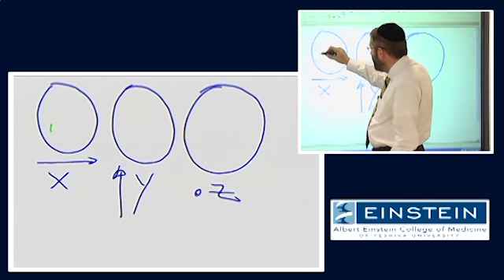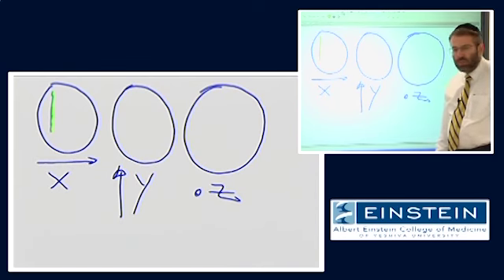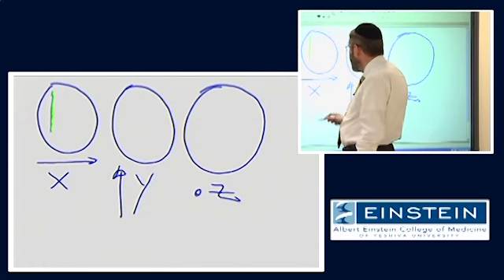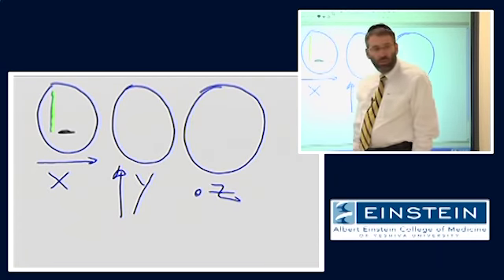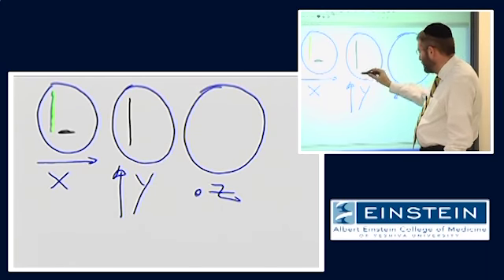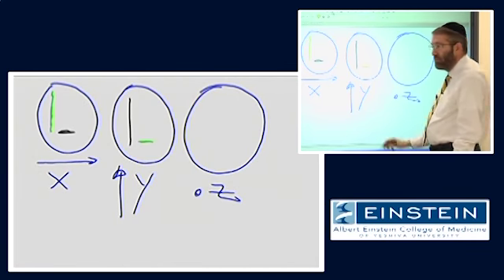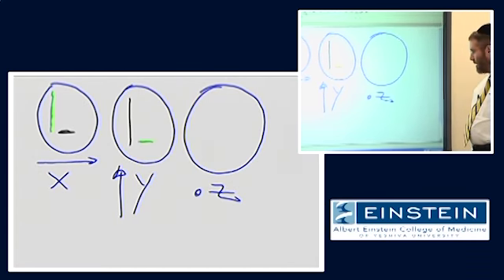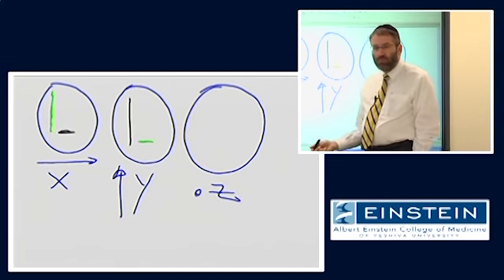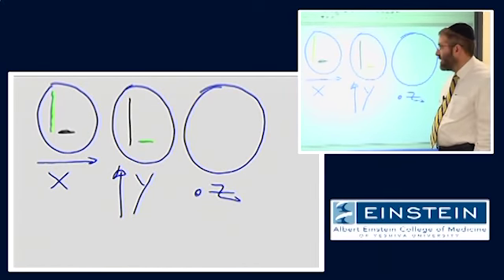We would have it along areas where there was diffusion perpendicular to the direction we're sensitizing. And we would have the lowest signal amplitude in areas where diffusion was along that direction. In this example, it would look like this. Okay. And if we looked at one more area, let's say the internal capsule, where diffusion is moving in and out, perpendicular to the slice.